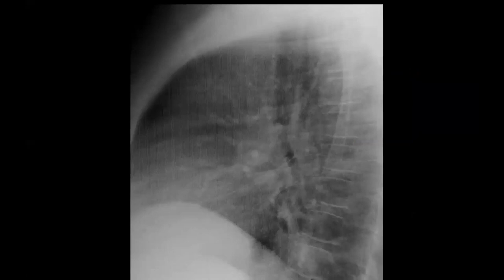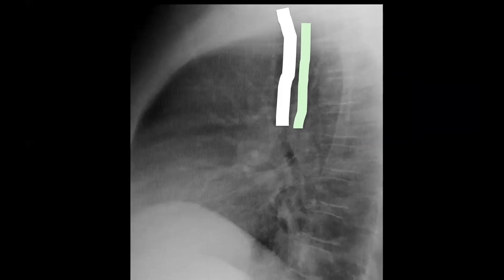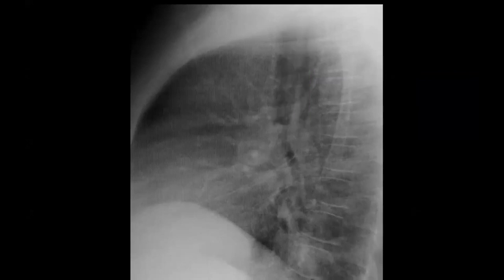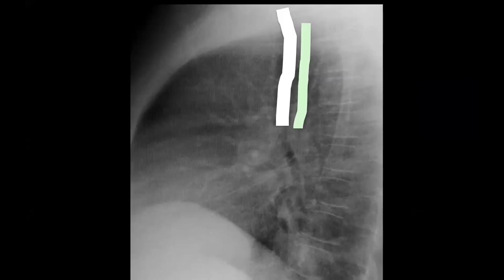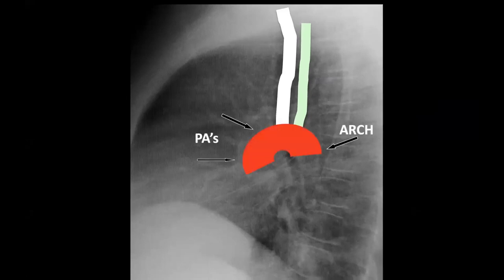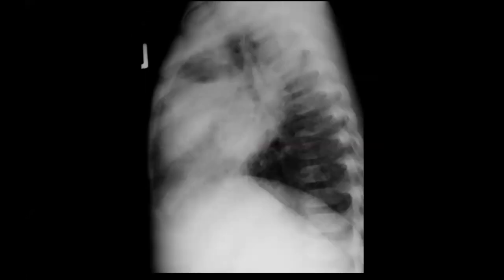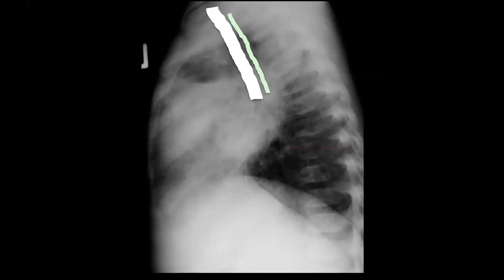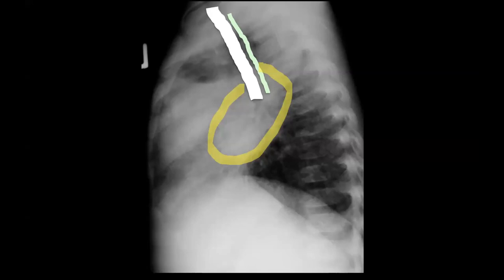Many people find the lateral difficult. On the lateral, we're trying to see a trachea that is parallel and straight relative to the esophagus behind it — two straight lucent channels, the trachea and esophagus. We always have density around the hilum because of the arch and pulmonary arteries, but you can see vessels through them. Compare that with the dense hilar region in pulmonary tuberculosis — this is the so-called 'pancake' appearance.